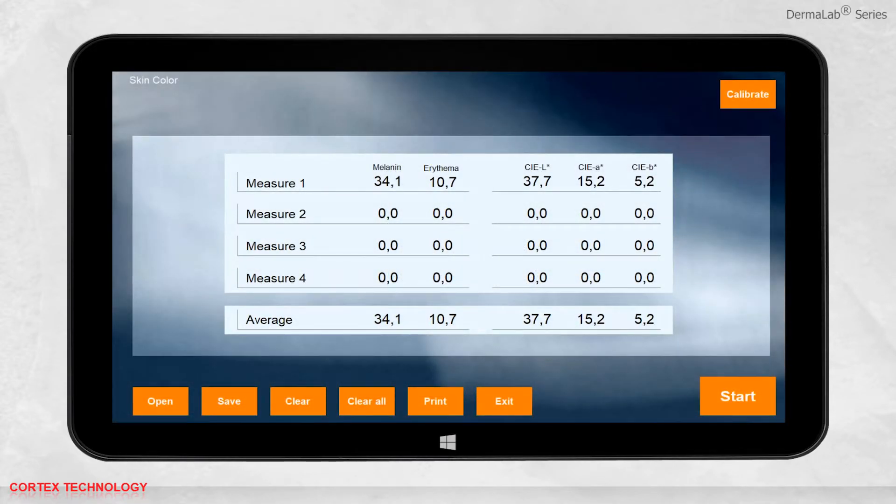After making a measurement, the results will be shown in the interface. The measurement is presented in erythema and melanin index as well as CIE lab color space, and you can change the name of the measurement.